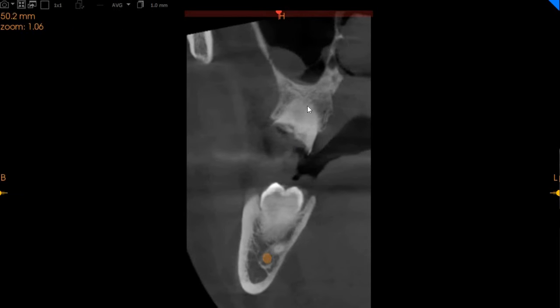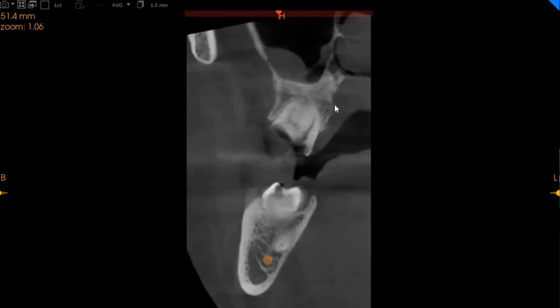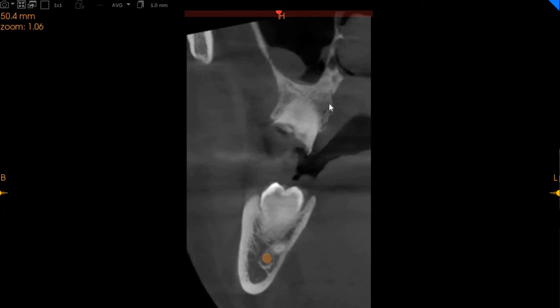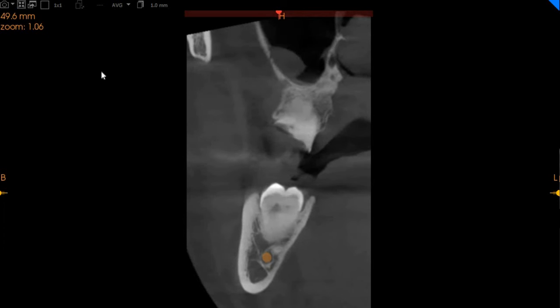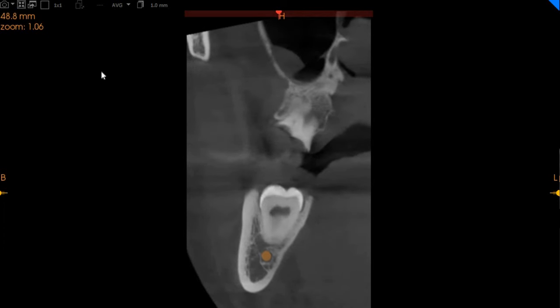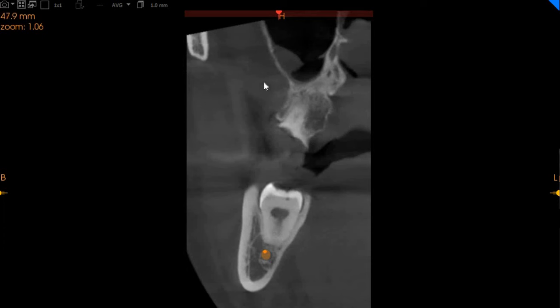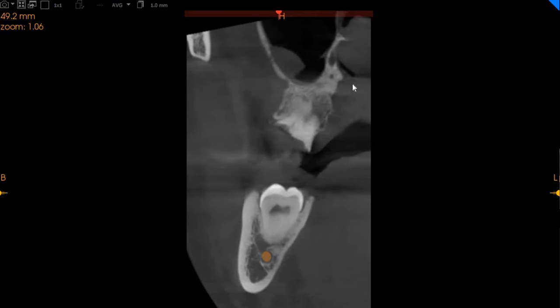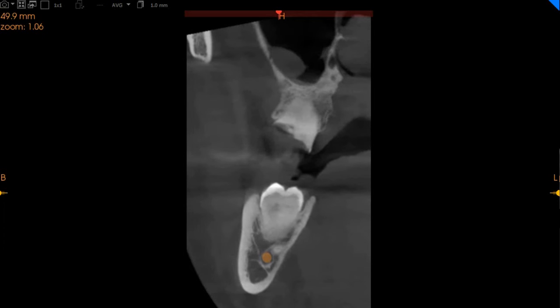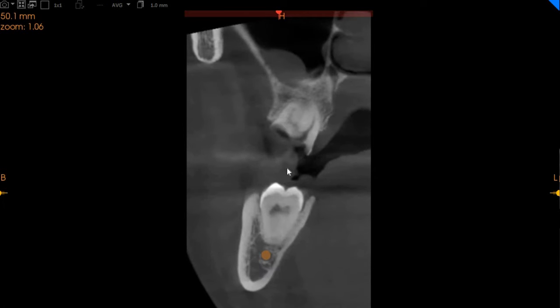On the axial view, you can see that the top right wisdom tooth is grossly carious. There is no periapical radiolucencies that can be seen with this tooth. However, this is a grossly carious tooth with no crown structure whatsoever, and we don't see any significant sinusitis associated with it.